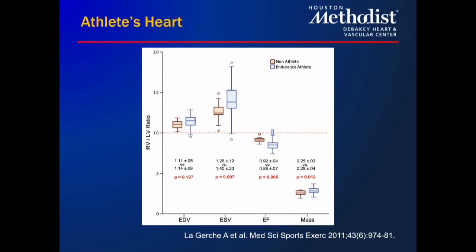Speaking of which, we quantify it similar to MR in the CMR world. We take the RV stroke volume and then take the PA systolic flow, and the difference between the two makes up the regurgitant volume and regurgitant fraction. One group did publish using a so-called phase contrast vena contracta, so kind of equivalent to looking at the vena contracta on echo, but using two CMR techniques for determining TR severity.